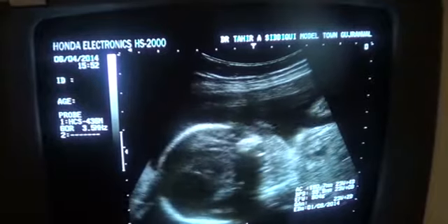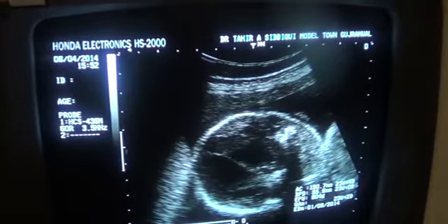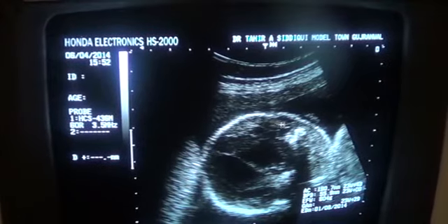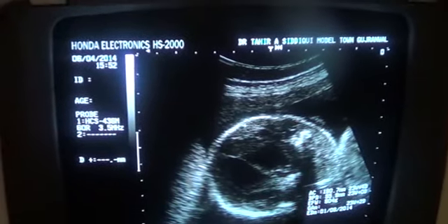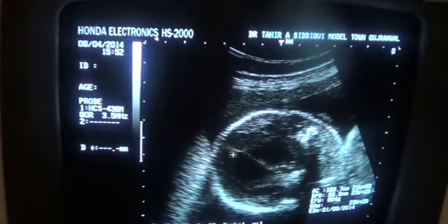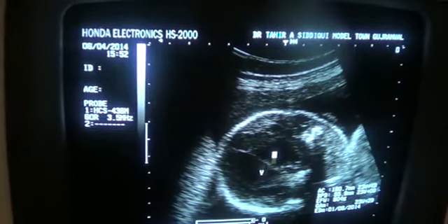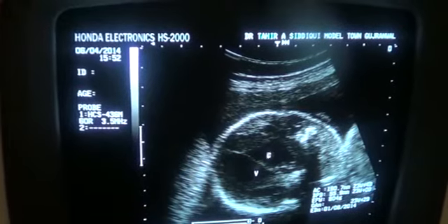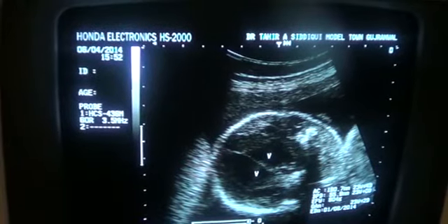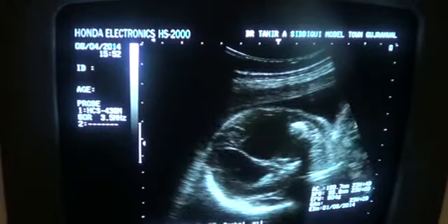The first baby is showing hydrocephalus with loss of cortical mantle. There is only a small amount of mantle seen in patches. Otherwise, this is the skull bone, this is the falx cerebri, and these are the dilated ventricles. This is the dilated ventricle. So this is a case of hydrocephalus of fetus number 1.